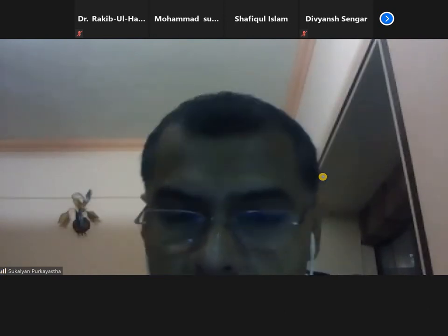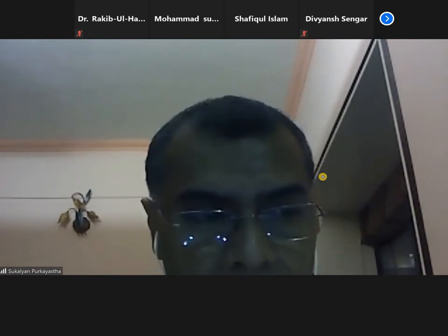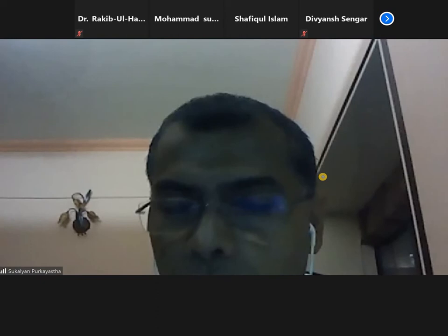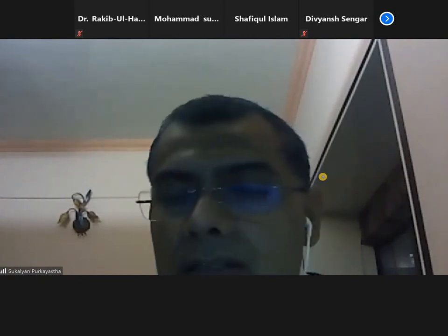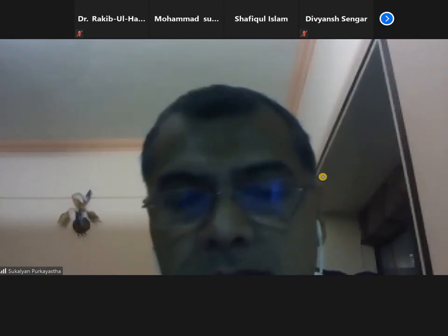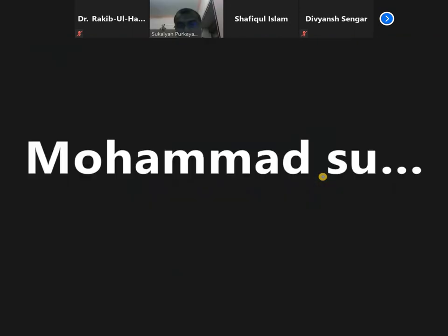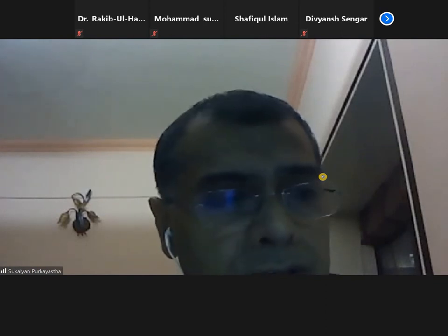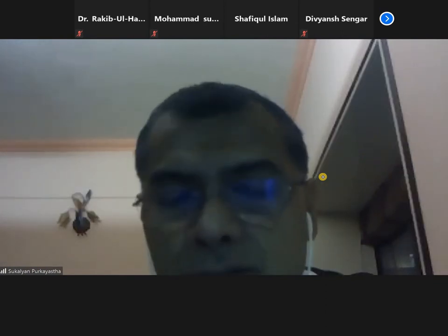So what you have done is absolutely right. You should do it in stages. It should not be done in one single stage. That is very important. Why? Because there will be a high incidence of this large sinus getting thrombosed. So it should be done in stages, and Onyx is a good choice because the lesion is in the wall of the dural sinus.